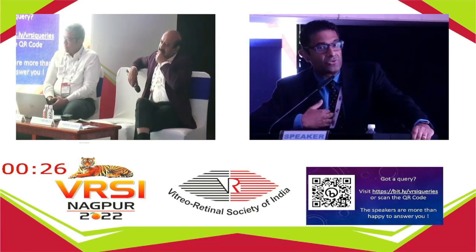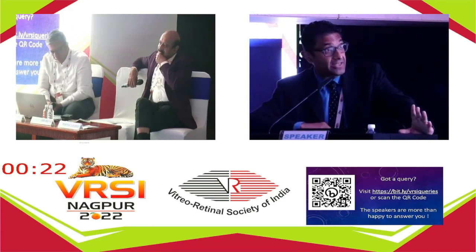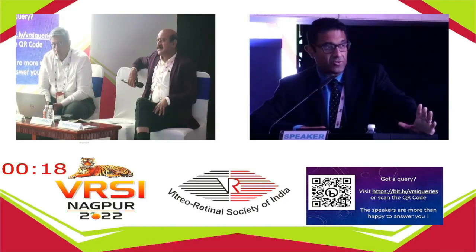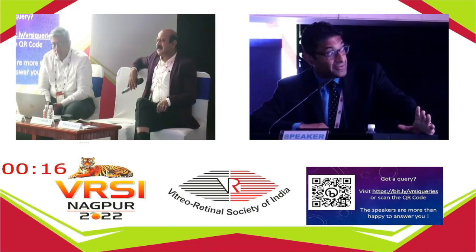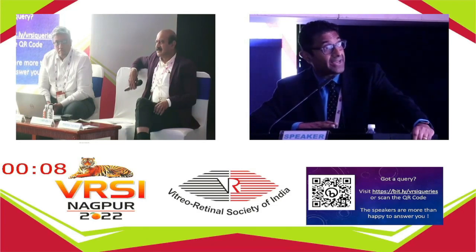And so, as I said, every new patient gets an ultra-wide field image, color and autofluorescence. I can't tell you how many patients we picked up on subtle abnormalities. Autofluorescence provides tremendous contrast for things that might be difficult. Some patients are difficult to examine. There are so many cases we've seen in clinical practice where our management has been impacted, which people have verified in prospective studies.